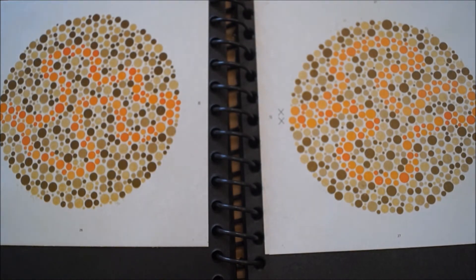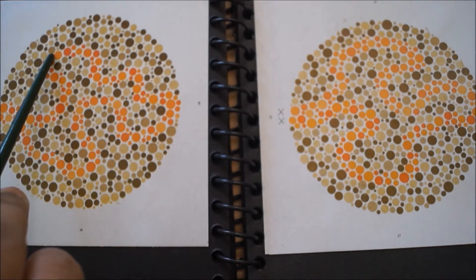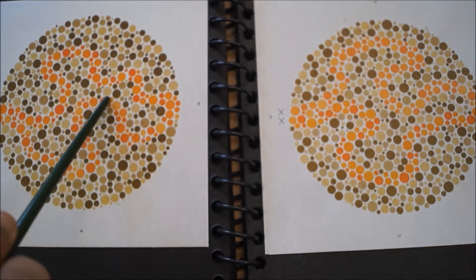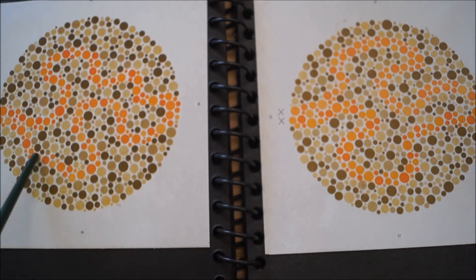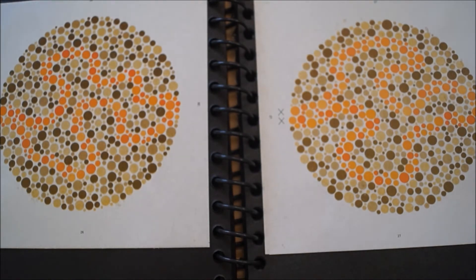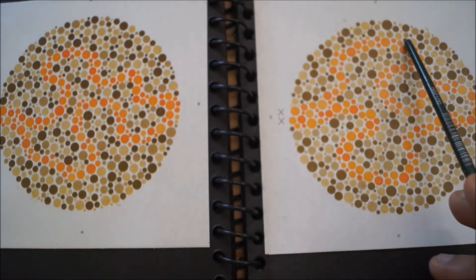Red filter, pattern page. Now the patient is asked to trace the pattern. There are two lines and the patient was seeing both lines equally clearly.